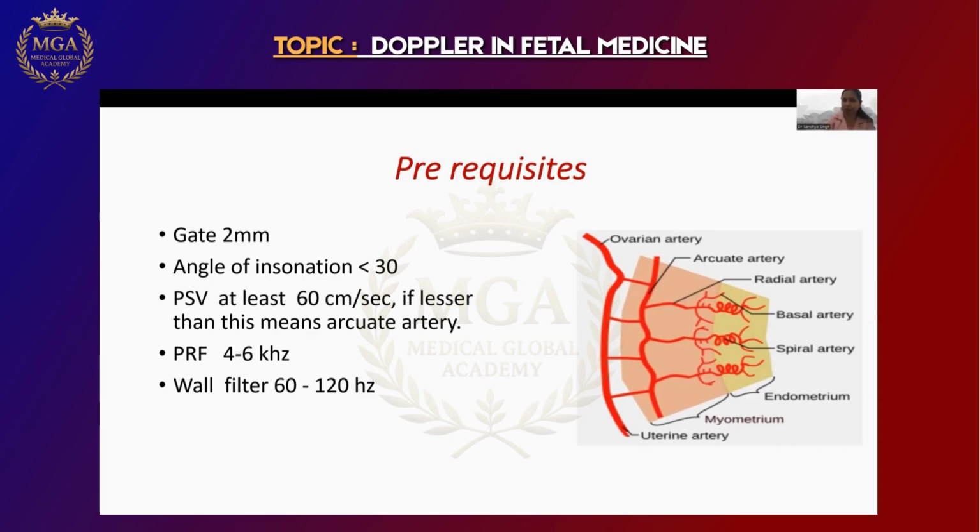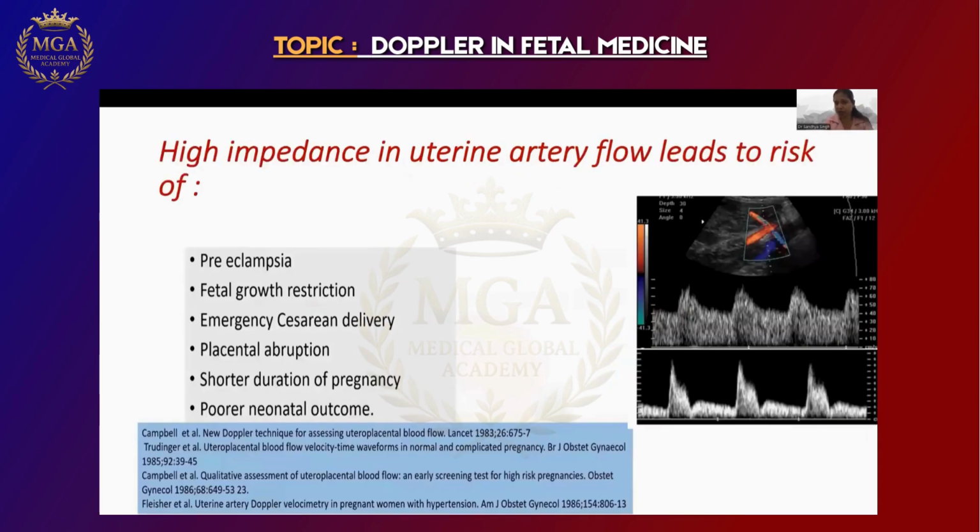as per the requirement. Now, when you do uterine artery, I have listed here so many conditions. You do uterine artery when there's preeclampsia, FGR, all this are gone now. Today, doing uterine artery is mandatory in each and every patient. Starting from NT scan, when we do NT, we do uterine because we have to screen for preeclampsia, because prevention is there.